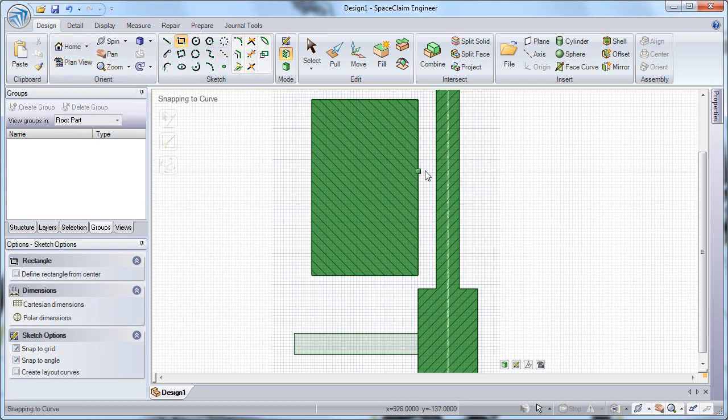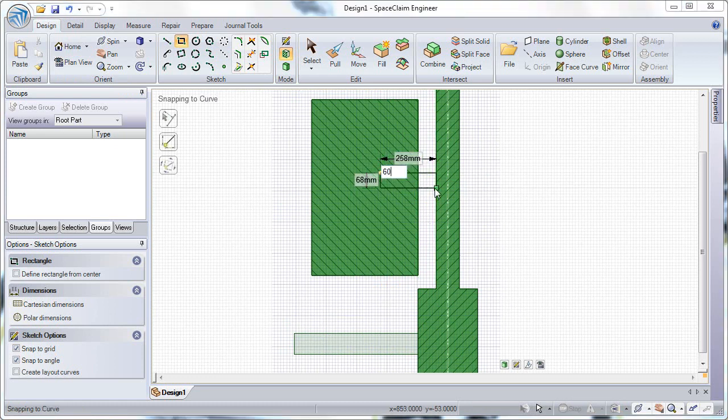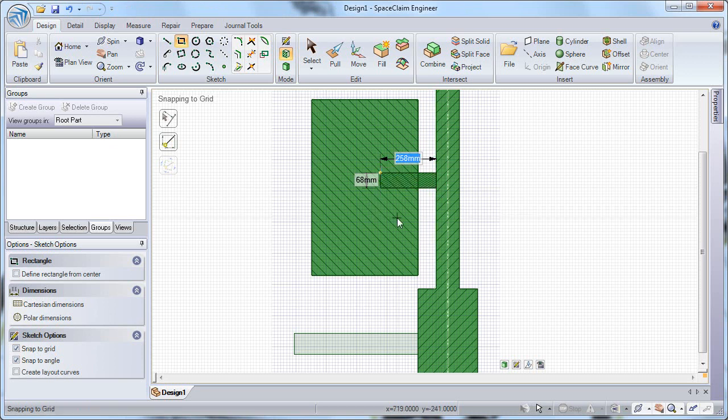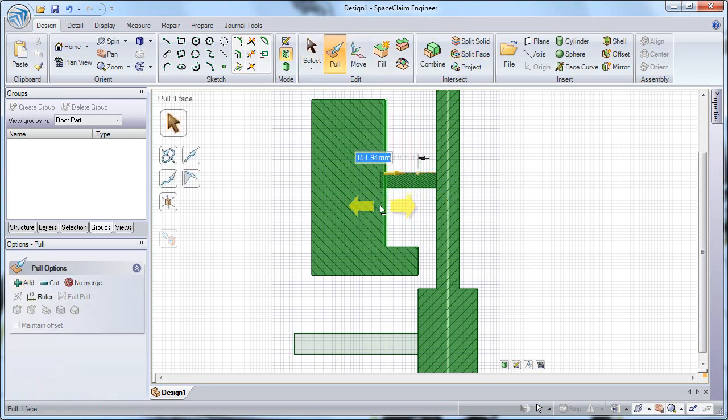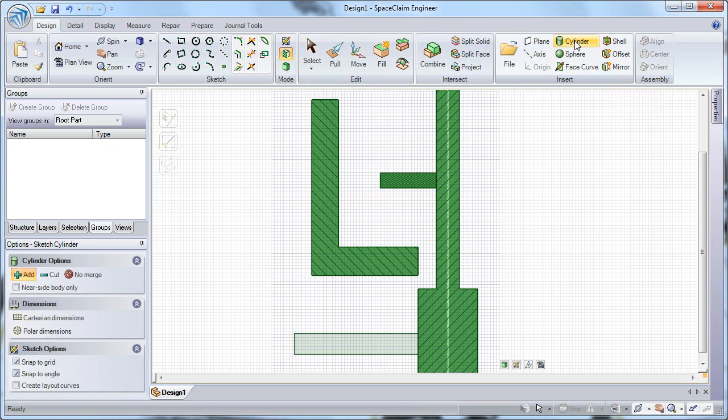Now I'd like to create my table for this medical cart. Still in section mode, I can specify a depth for that table of 600 millimeters, snap that to my tower on the right, and complete that rectangular sketch. Now I'd like to split my face along the front of this large rectangle. It's representing my chair, so I'll split that halfway down, and using my pull tool, I'll pull on the top half of that face to make it look more like the shape of a chair. Then I'll create a quick cylinder, sketching it to connect between the chair and the base as a stand for that chair.